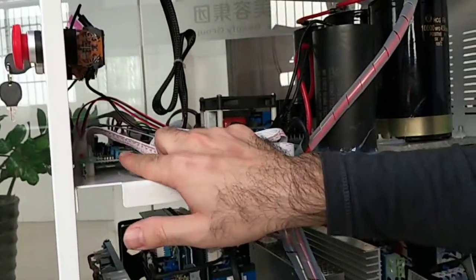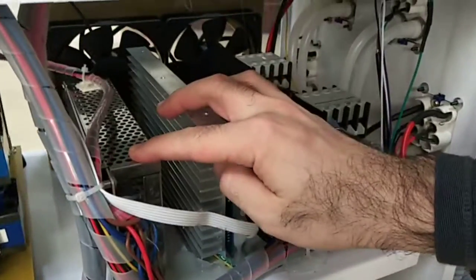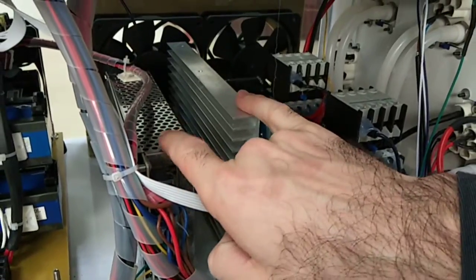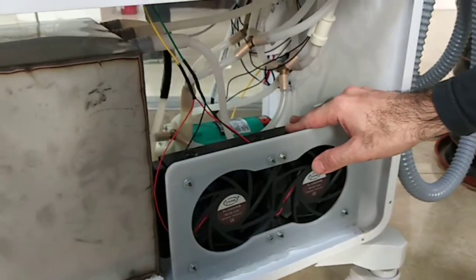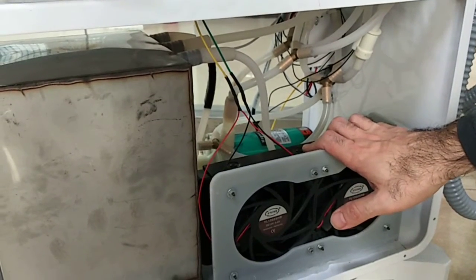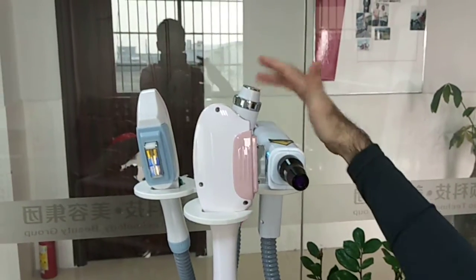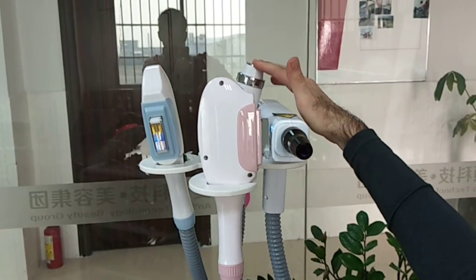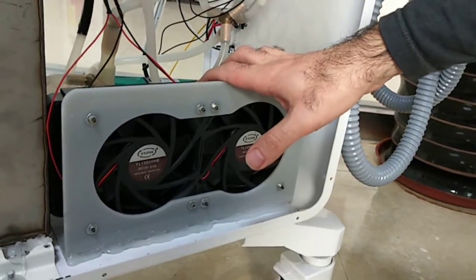And this one is the main controlling PCB. That's the main one that controls it all, and it is powered by this small power supply in here. This small power supply powers up all the low voltage PCBs, and it also powers up this fan here. These two fans are the heat dissipators for the refrigeration of this unit. Because, as you remember, the 1, 2, and 3 heads have got the cold function. If you leave them to operate for a while, they become frosty because of the cold function. And this one is the part that dissipates the heat of the unit.